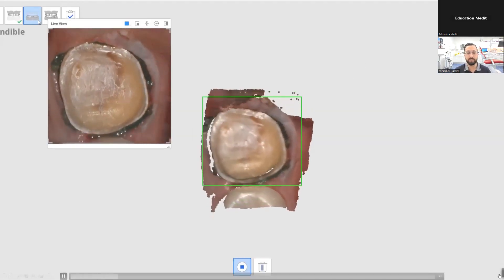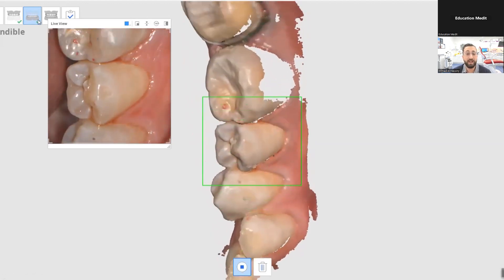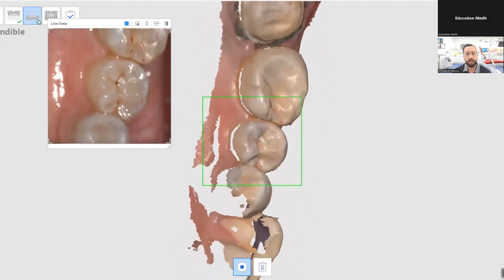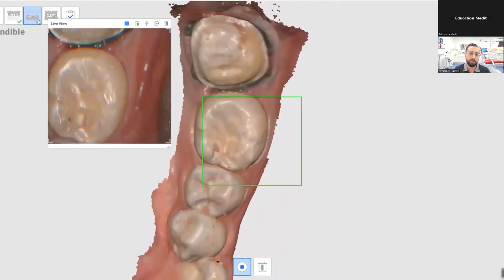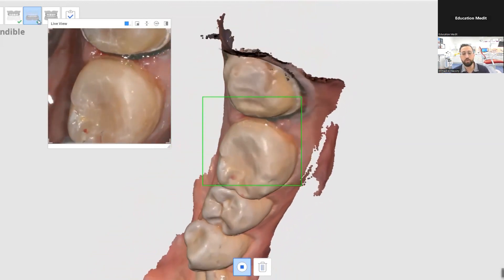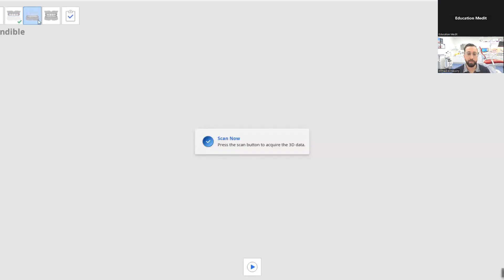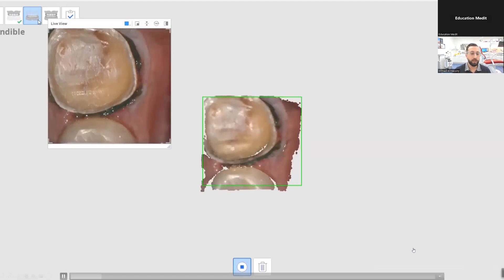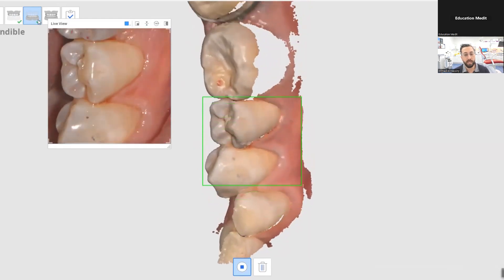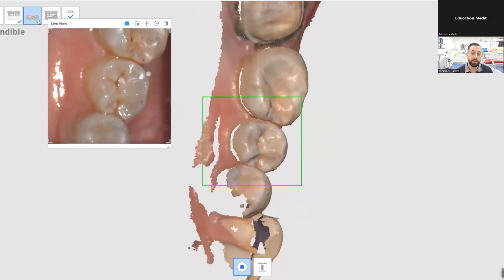So we know scan strategy, and as you can see in this video, this is exactly how it's done even for a crown. While I'm scanning this crown live, I don't focus on the crown prep — a common mistake I see is people focusing on the crown prep too much. I do my occlusal scan, then buccal, and then lingual. I go across the occlusal, rotate buccal, and then lingual.